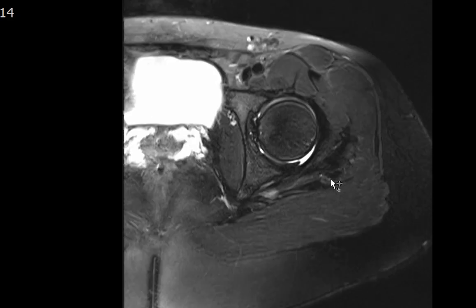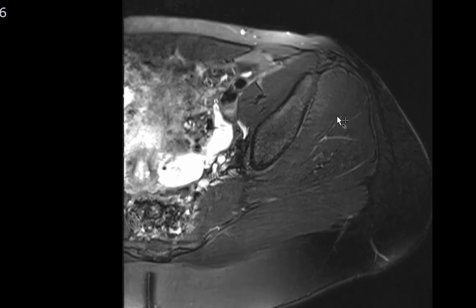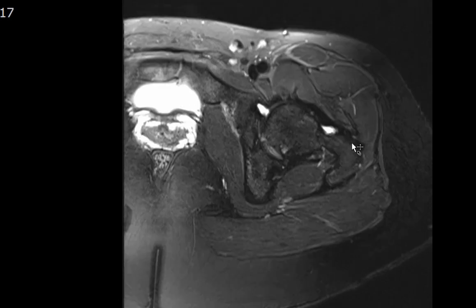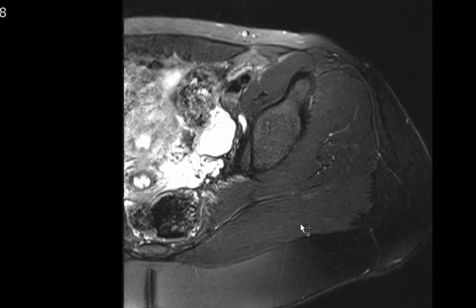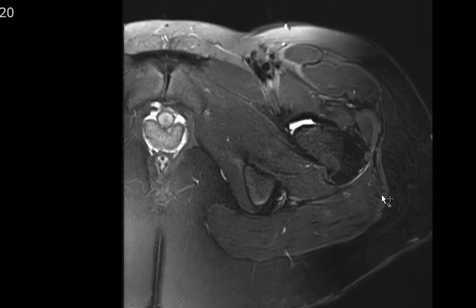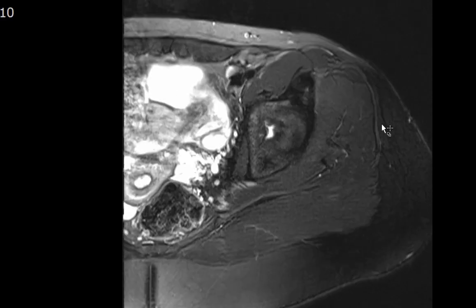Just deep to the gluteus medius tendon is a potential space called the subgluteus medius bursa — no fluid distending it to suggest subgluteus medius bursitis. The gluteus minimus tendon inserts onto the anterior facet of the greater trochanter, with the subgluteus minimus bursa deep to it — no fluid to suggest bursitis. The gluteus maximus does not insert onto the greater trochanter; it inserts onto the linea aspera along the posterior femur. However, the gluteus maximus gives fibers to the iliotibial band, which originates from the iliac crest and tensor fasciae latae muscle and inserts distally at Gerdy's tubercle along the knee.